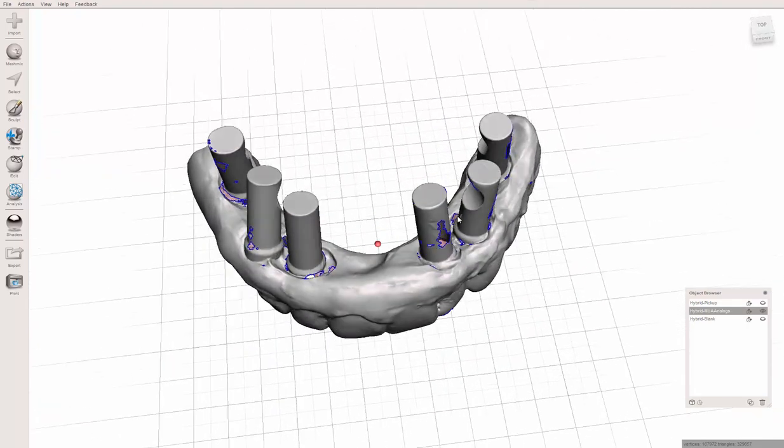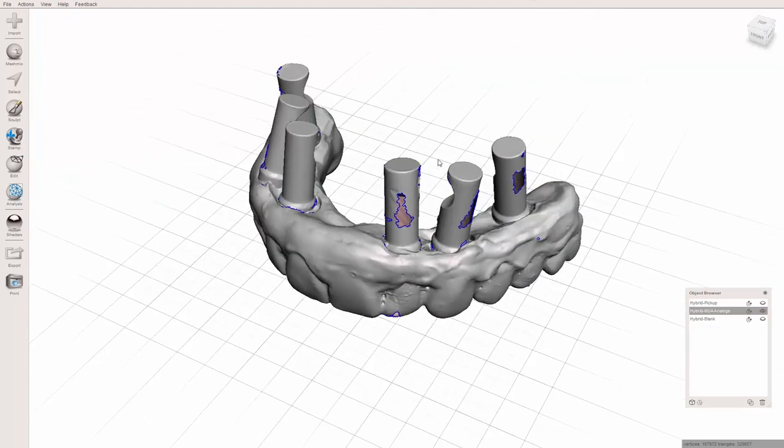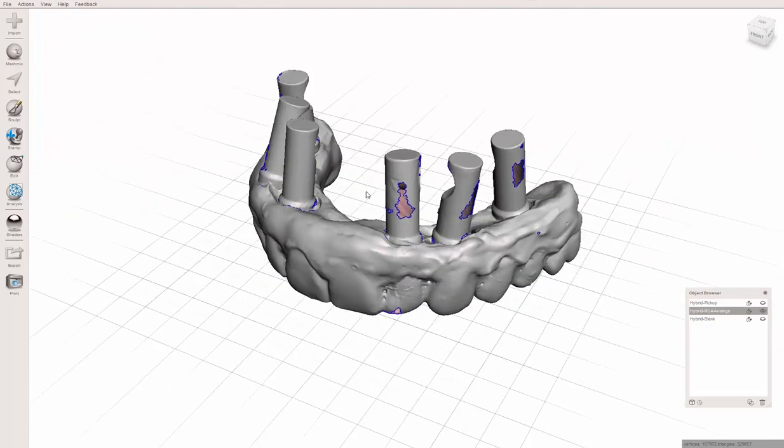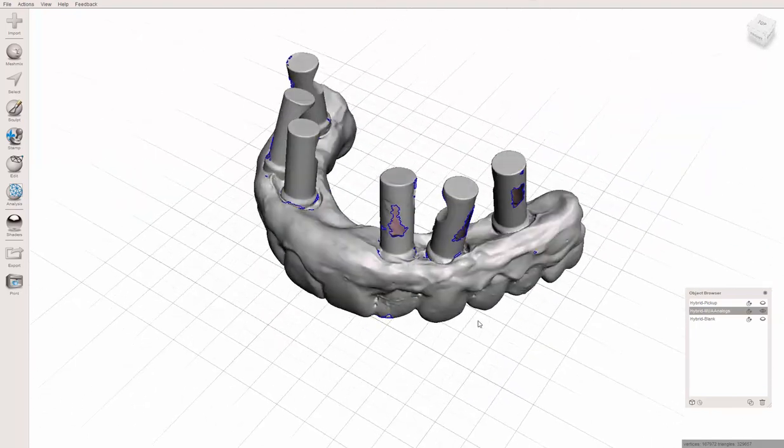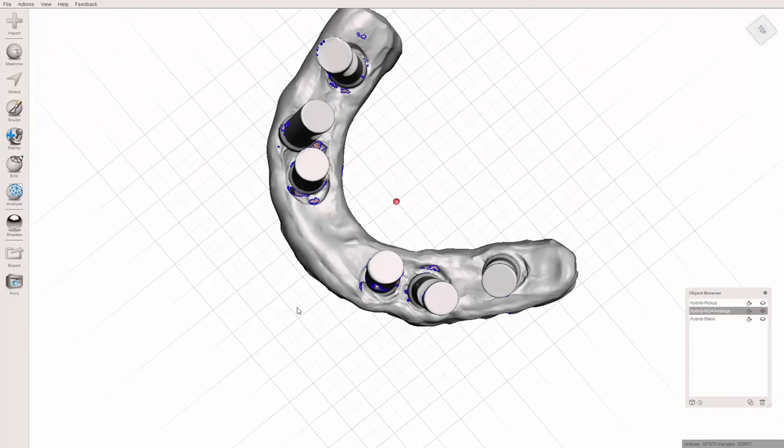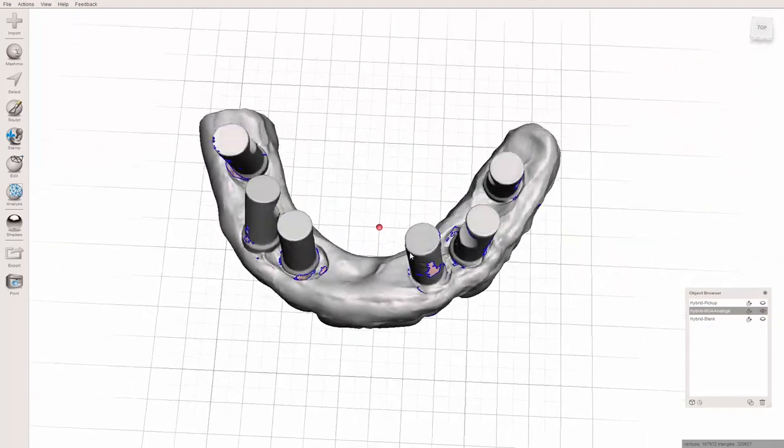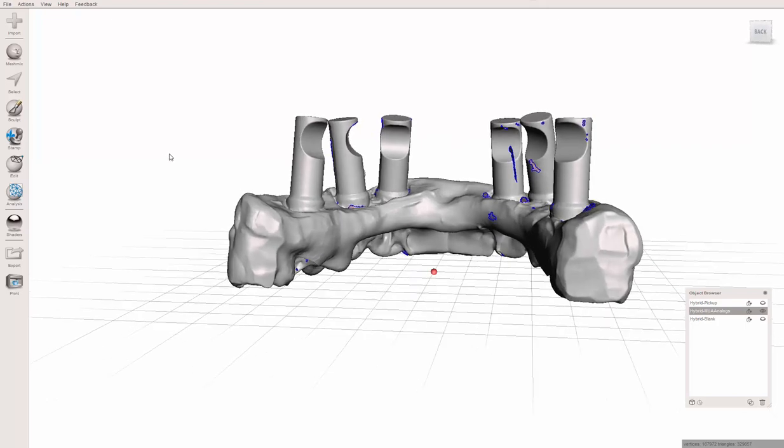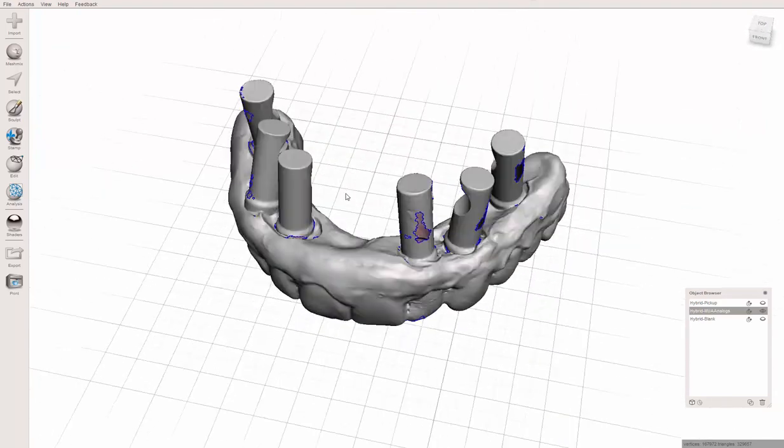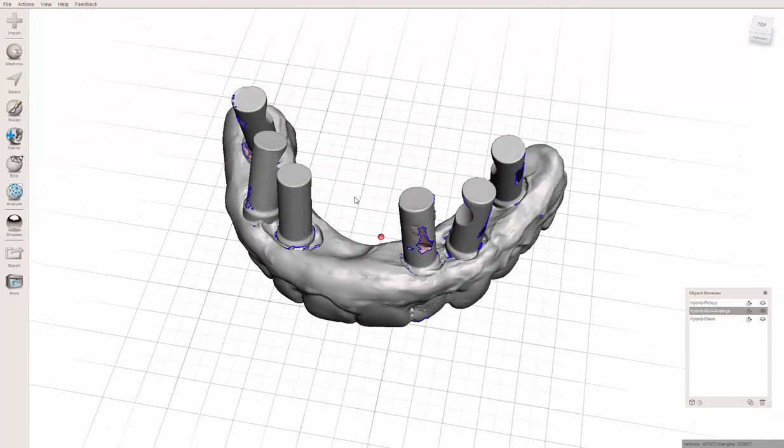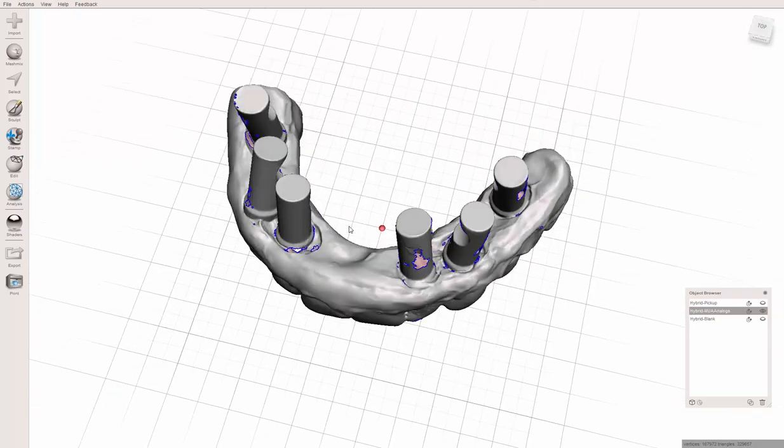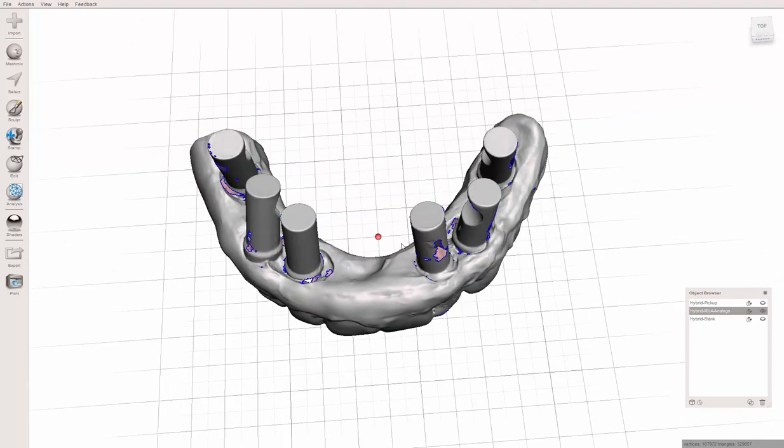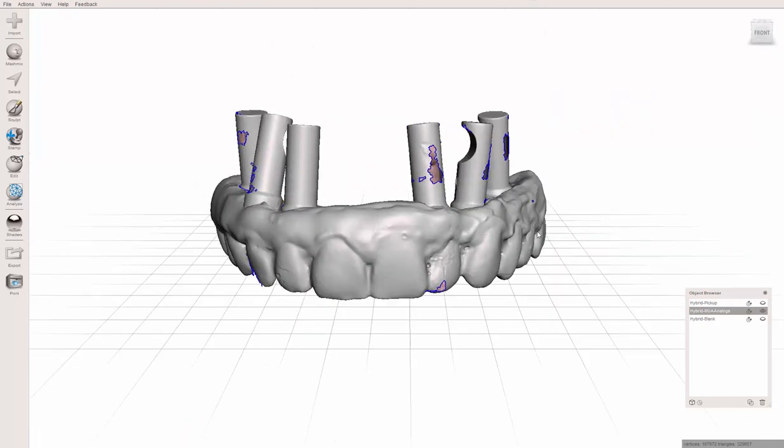After I've scanned this, I'm going to add scan bodies into these - they're actually just the actual analogs that you would use in a model. The important part is getting a nice flat top and getting as much as you can get. It is nice if you can strategically remove them and keep scanning, and lock that area. I also did use some powder, OptiSpray, just a light dust of it to reduce the reflectiveness.